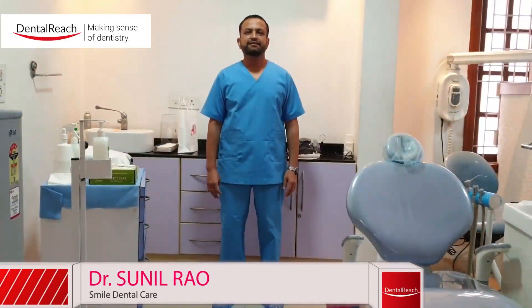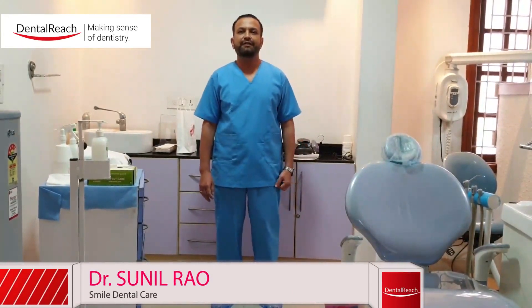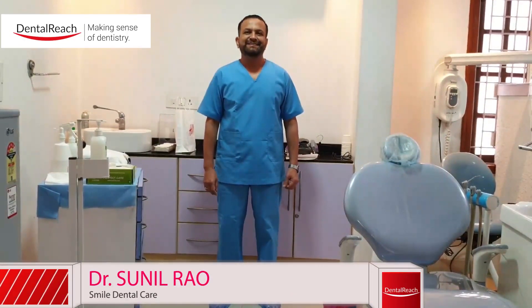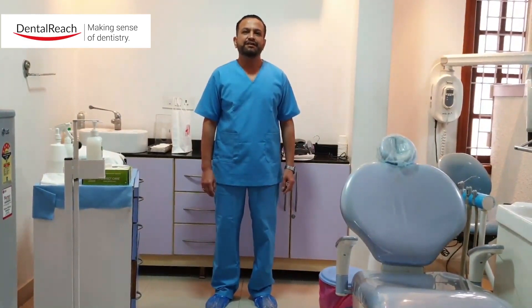Hi, my name is Dr. Sunil Rao and I'm here to give you a demonstration on the donning and doffing of Sterline protective wear CBU 600 by Confident Dental Equipment. So without much ado, let us start off.